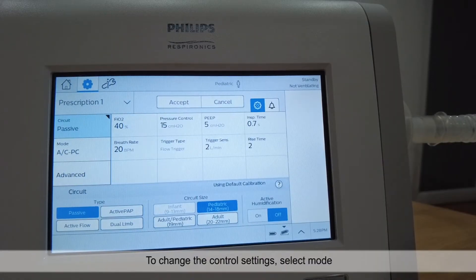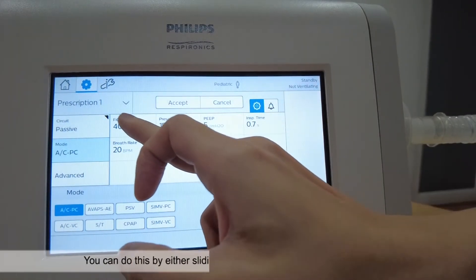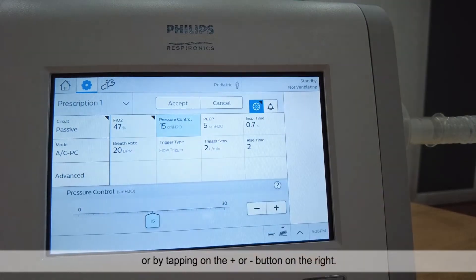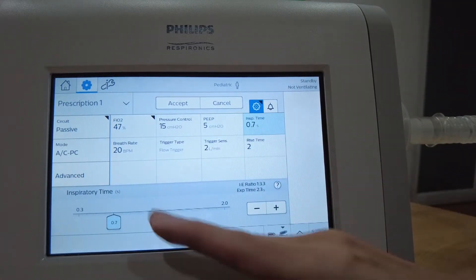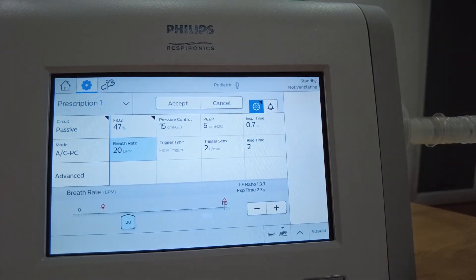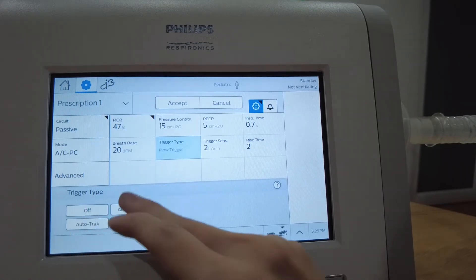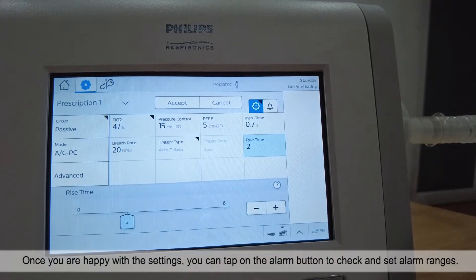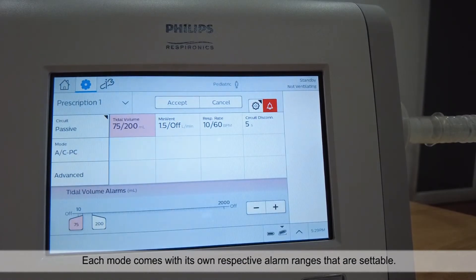To change the control settings, select mode and then select the preferred mode. You can select its parameters to change the settings by either sliding to increase or decrease the parameters, or by tapping on the plus or minus button. Once you are happy with the settings, you can tap on the alarm button to check and set your alarm ranges. Each mode comes with its own respective alarm ranges that are settable.